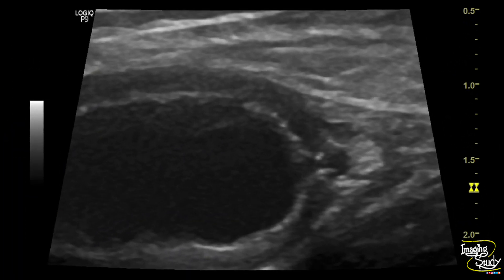Here is the magnified image where we can see the communication of the adjacent fluid-filled area, surrounded by a thick rim of fat, with the appendicular lumen.